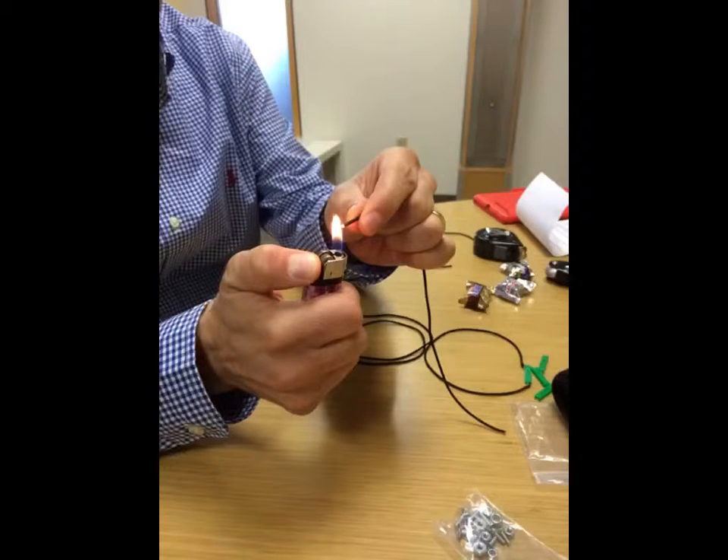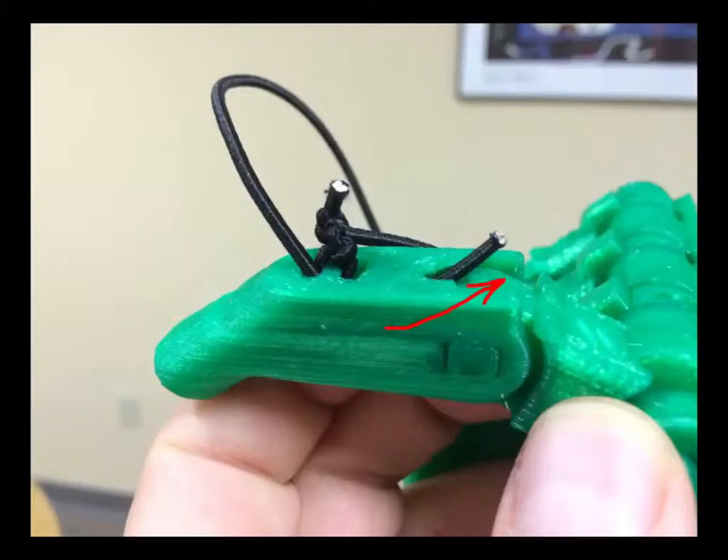Here in this picture, you can see we're trying to burn the ends of the flexible elastic cord so that the ends won't fray as we pull it through the holes. As you can see, we had to tie many knots to secure the elastic cord to the hand, and we had to pull it through very tiny holes, so this whole process took a very long time.